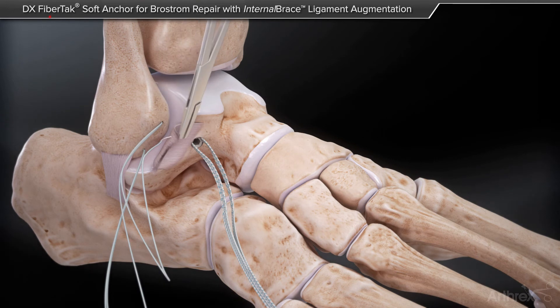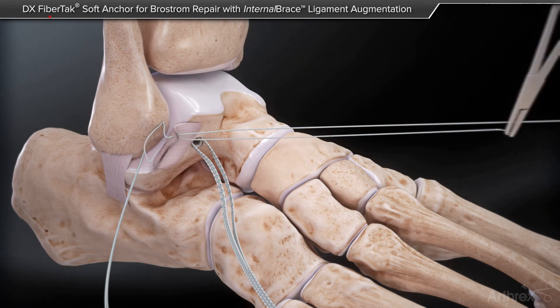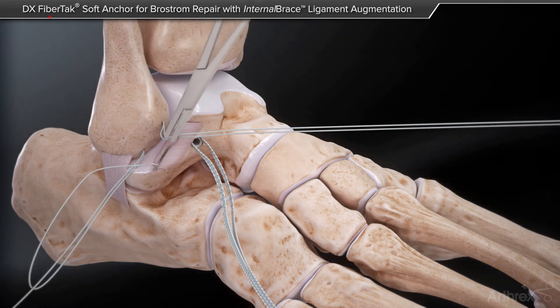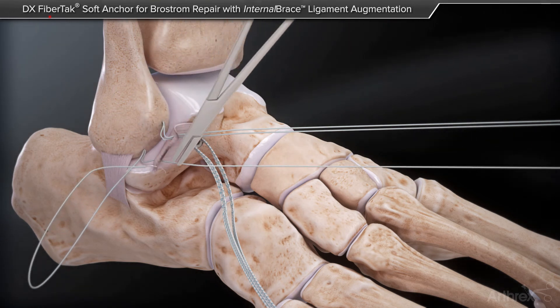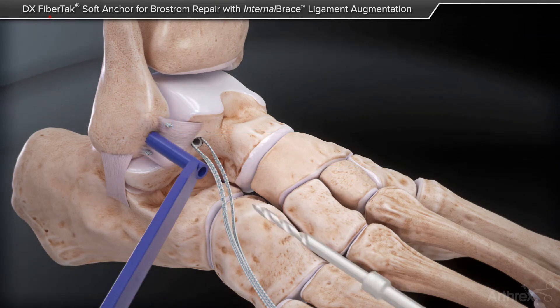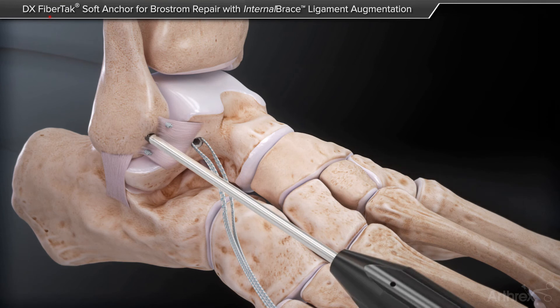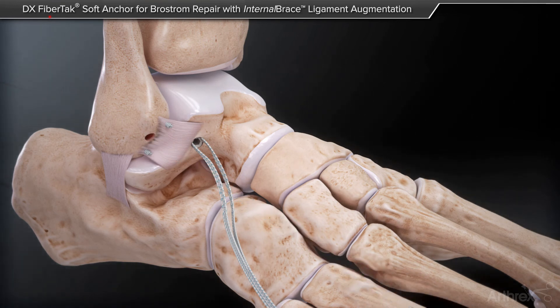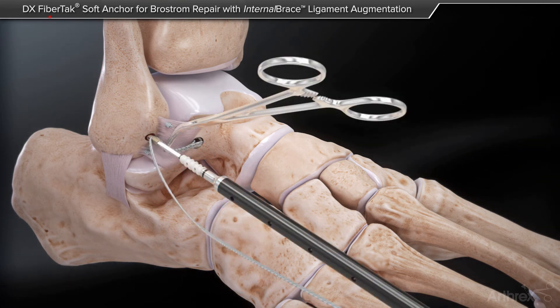We proceed with the modified Brostrom repair, where we pass the two limbs of each FibreTac Suture Anchor to capture the native ATFL — the anterotalofibular ligament — and the inferior extensor retinaculum, classifying that as the modified Brostrom. As you tie these down, the foot is held at maximal eversion. Then the foot is allowed to rest in physiologic equinus position, and this is when the internal braces are fixed — at a different tension. It functions as a seat belt, a backstop to prevent motion beyond a point of injury.